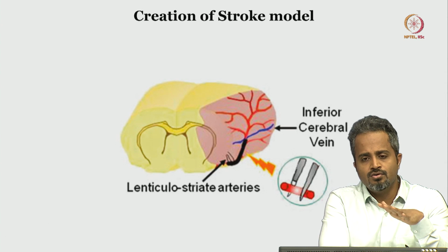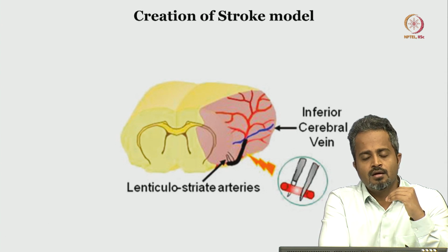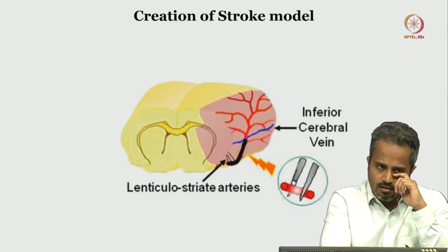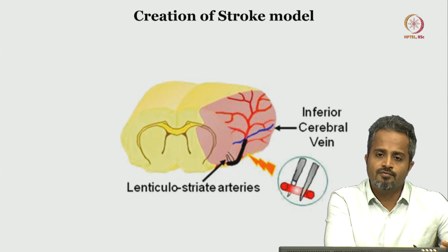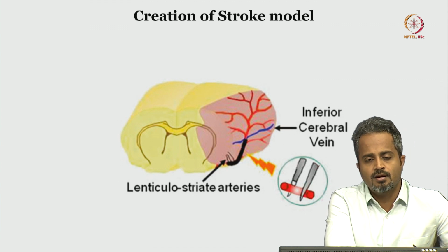Whereas if you're trying to do anything below the temporal ridge of the rat, then the position is lateral. All right. So for all the positions that you use for parietal craniotomy or frontal craniotomy, the rat is going to lie on its belly, and it's a pretty standard position and it's easier to handle.